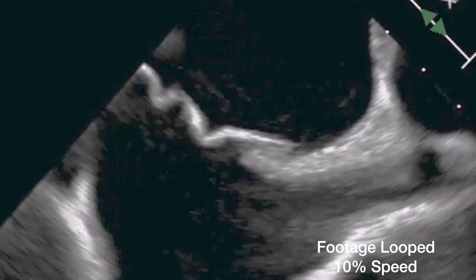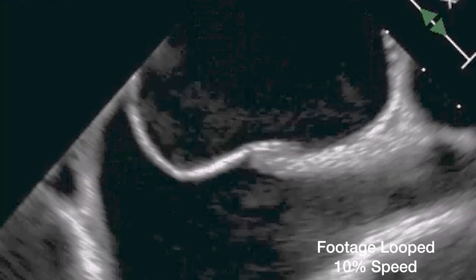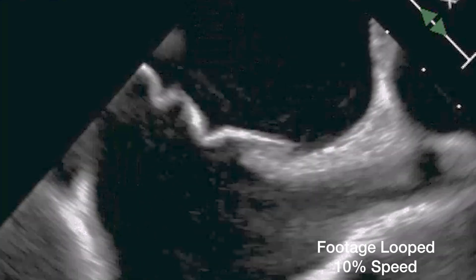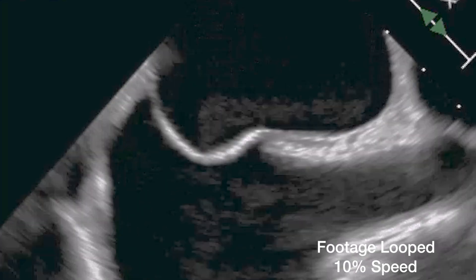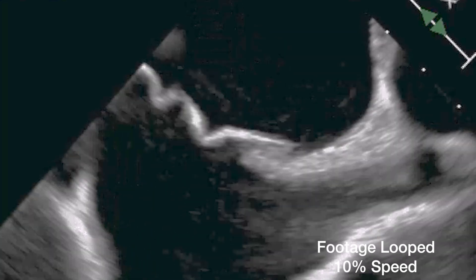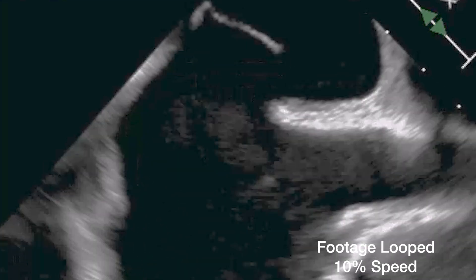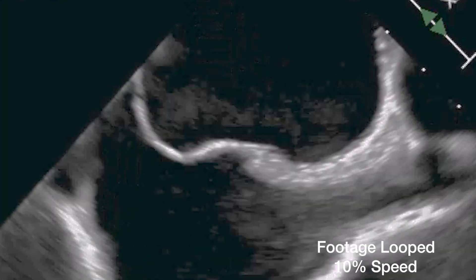The large shunt here is defined as more than 20 bubbles appearing within the left atrium within three cardiac cycles after venous injection of agitated saline.